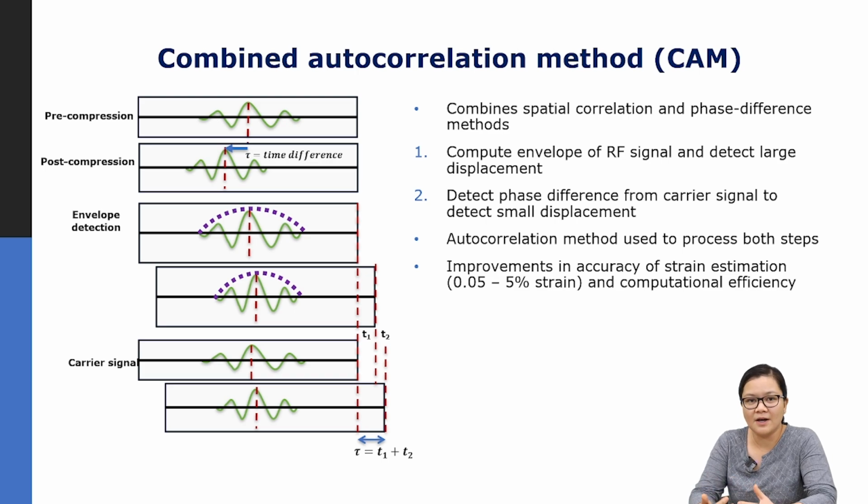Now, there's been a lot of research looking into other displacement tracking algorithms, and I would welcome you to look into those algorithms. However, they're beyond the scope of this course.